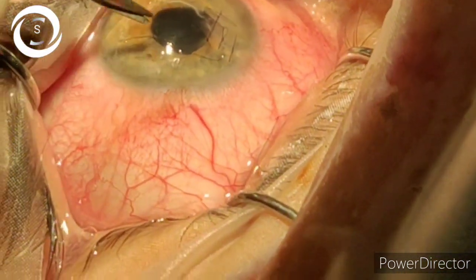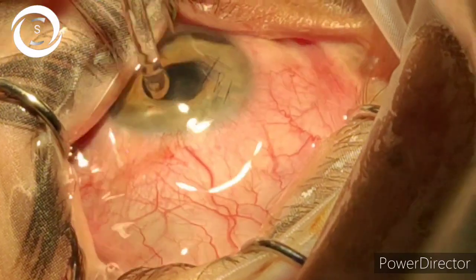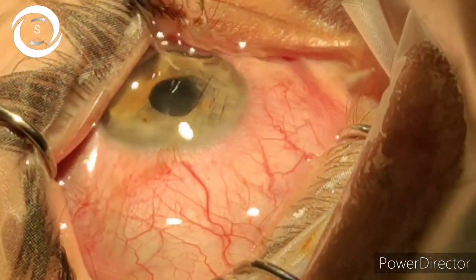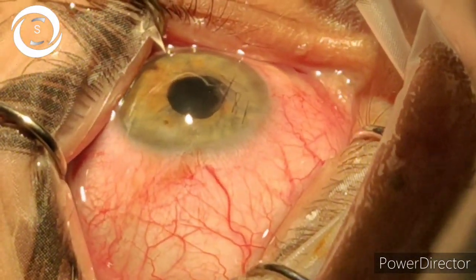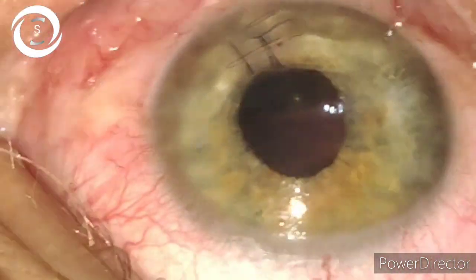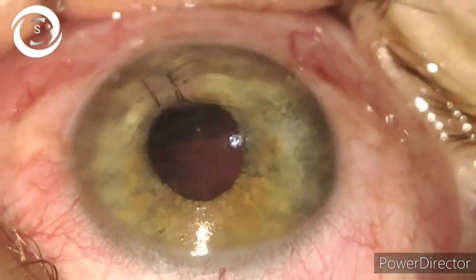For this corneal tear, five sutures were enough and the anterior chamber was well formed. At the end I put a subconjunctival gentamicin and dexamethasone injection. Post-operatively, cycloplegic and broad-spectrum topical antibiotic drops were prescribed, and I will also show you the post-op picture. Thank you very much.